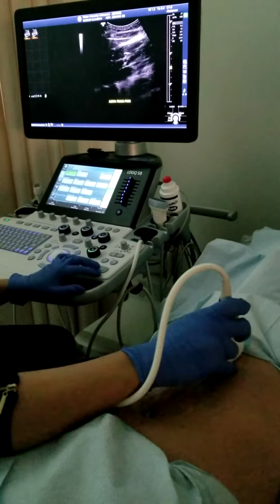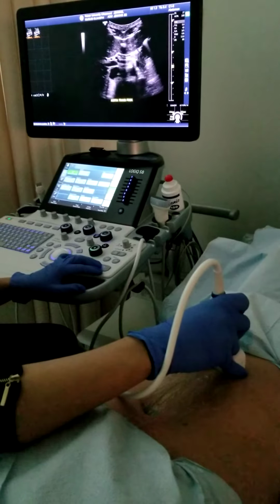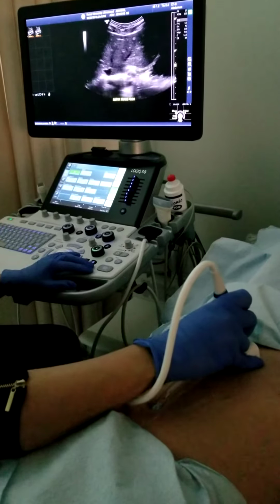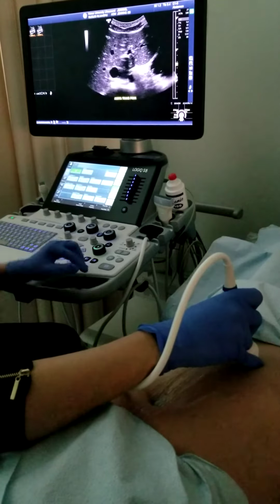Next image is going to be aorta transverse prox. So I'm going to turn my indicator towards me. I'm still in the same spot. Take a breath in, please. All right, so I'm going to sweep up towards the liver and start coming back down. I can see my IVC here, and I can see my aorta.